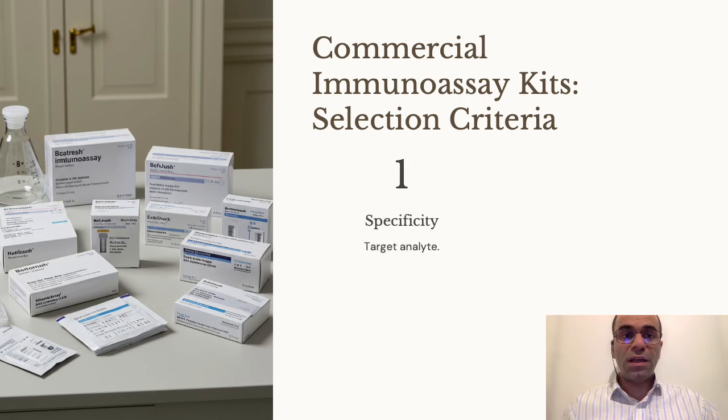Number one is specificity, the ability to detect only the target analyte with minimal cross-reactivity to similar compounds. High specificity reduces false positives and ensures the assay measures exactly what you intend to measure.